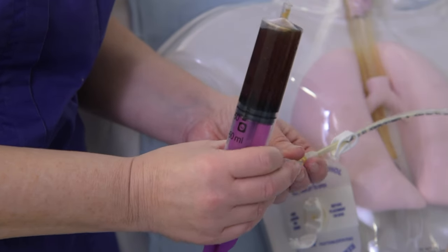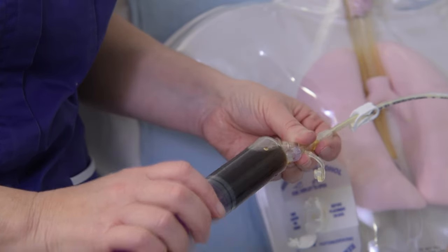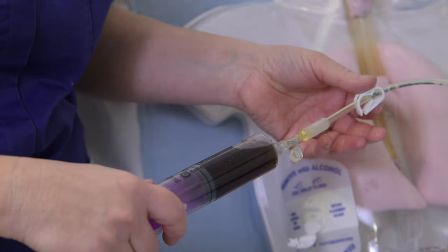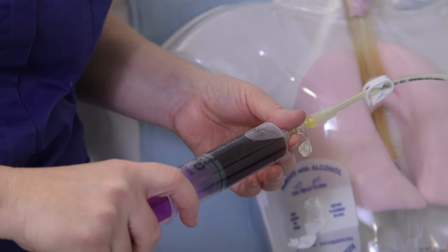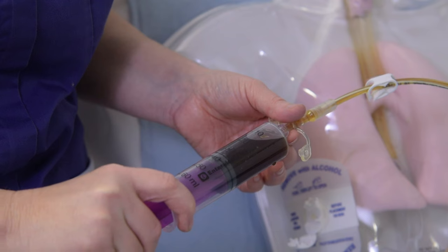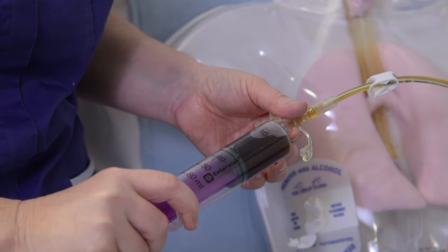Attach the syringe to the Y connector. Unclamp the tube. Using a push-pause technique, gently push the plunger on the syringe until all the medication has been given.